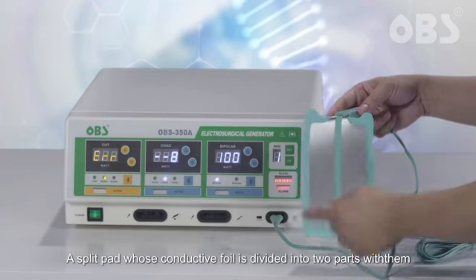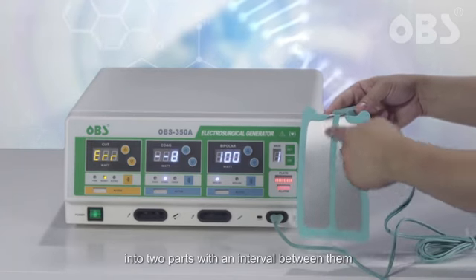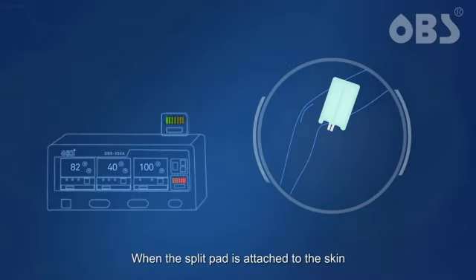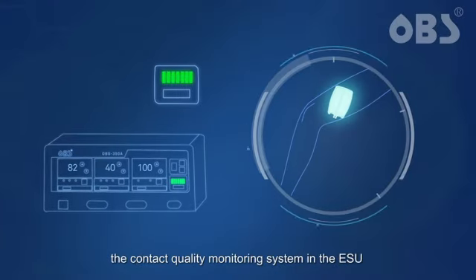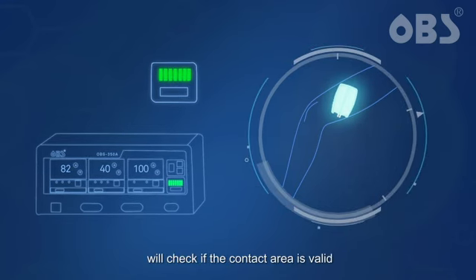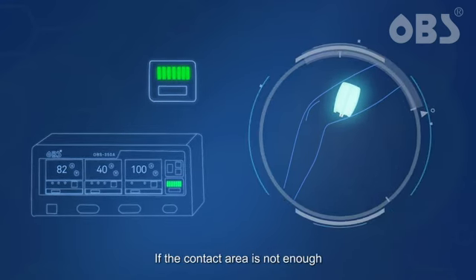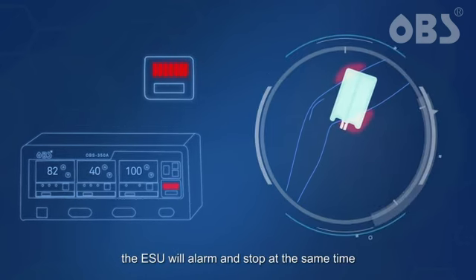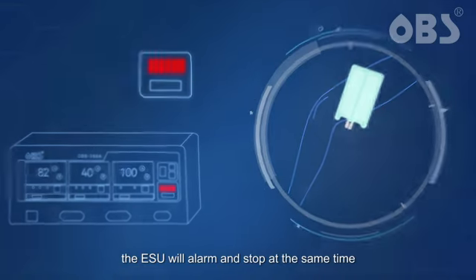A split pad has its conductive foil divided into two parts with an interval between them. When the split pad is attached to the skin, the contact quality monitoring system in the ESU will check if the contact area is valid. If the contact area is not enough, or there is a short circuit, the ESU will alarm and stop at the same time.